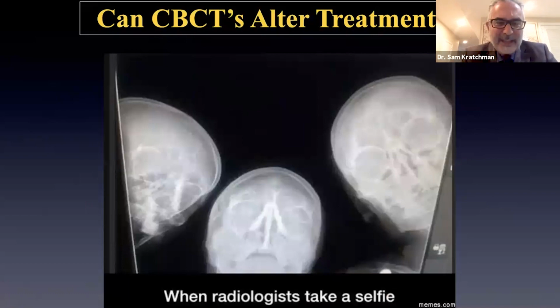Question: can the cone beams alter your treatment? We talked about some cases with resorption where after taking the cone beam, I knew that I couldn't treat the case. So I did save the patient the problem of having a root canal done.